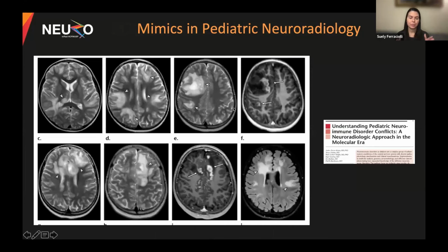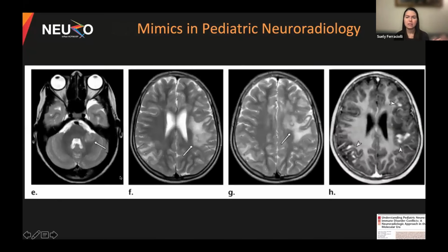And also this is one appearance of leptomeningeal enhancement. You can also think about it when you see encephalitis with this kind of leukodystrophy pattern of imaging. So you see all these lesions with mass effect, with heterogeneous enhancement. It looks weird and it doesn't feel right. It doesn't have that mass effect that you should see in an infectious process. What is this? This was a MOGAD encephalitis.